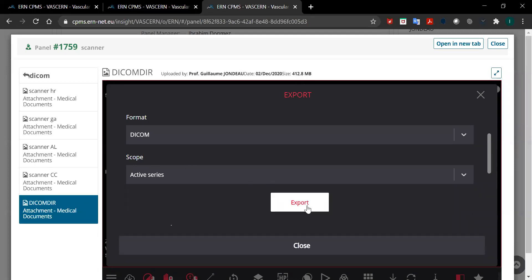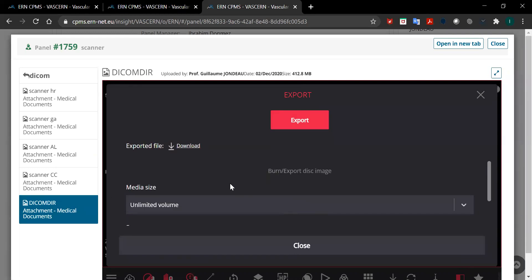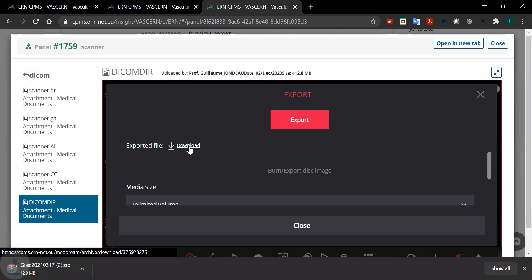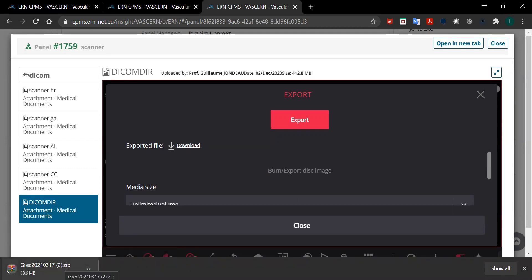Then you need to click on export and after several minutes when the file is ready, a download button will appear here at the bottom. When you click on this button you will see a zip file here at the bottom.